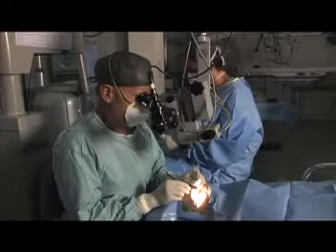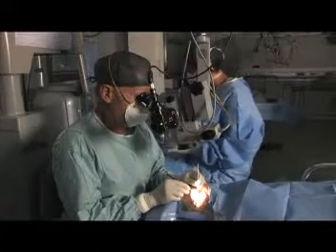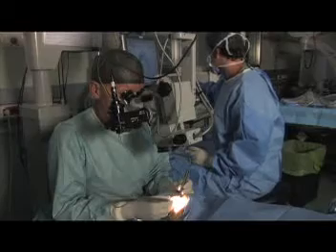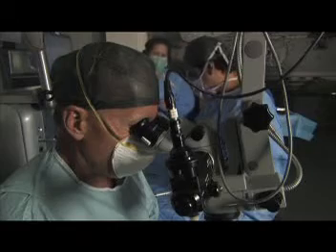It is a very flexible lens that goes straight forward into the capsular bag and should be placed inside the capsular bag with a notch, which is visible in the lens, oriented towards the six o'clock position. This guarantees that the lens position will be adequate for the optical purposes of the lens. The marks indicate the horizontal level at which the lens should be placed.